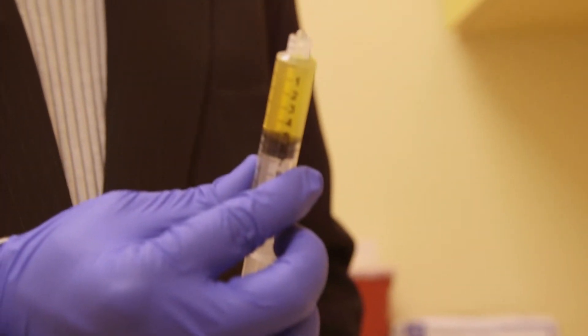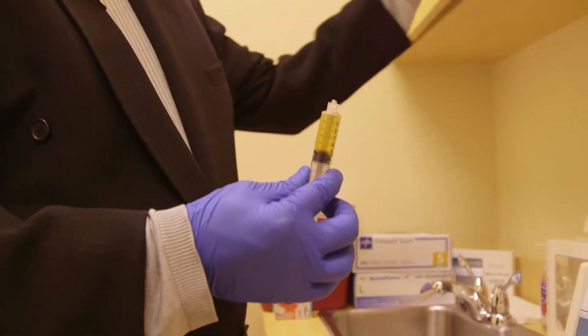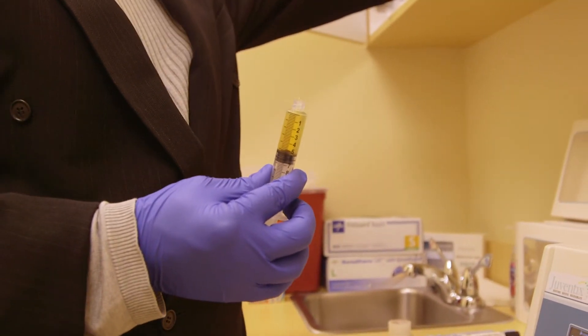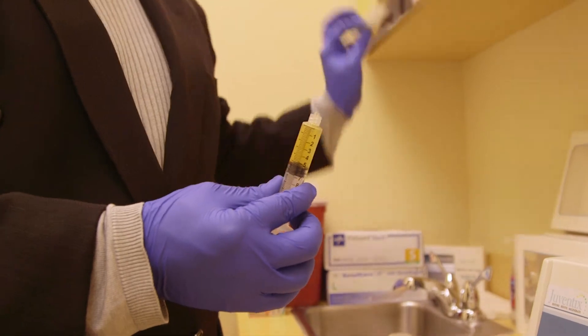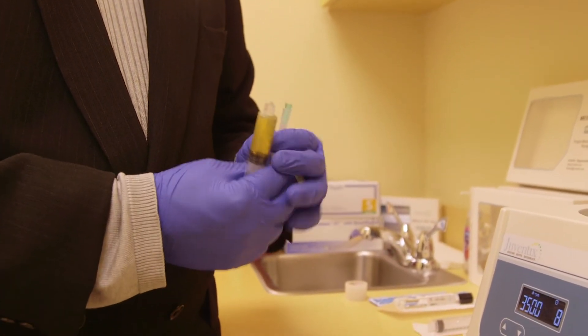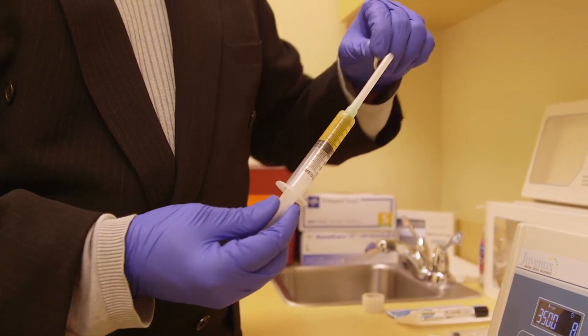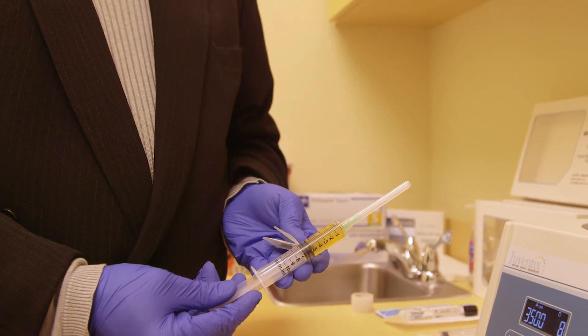Now you have your plasma prepared and ready for injection. We're going to take a 21 gauge needle for the injection into the large joint, attach the vial, and we're ready to proceed with the procedure.